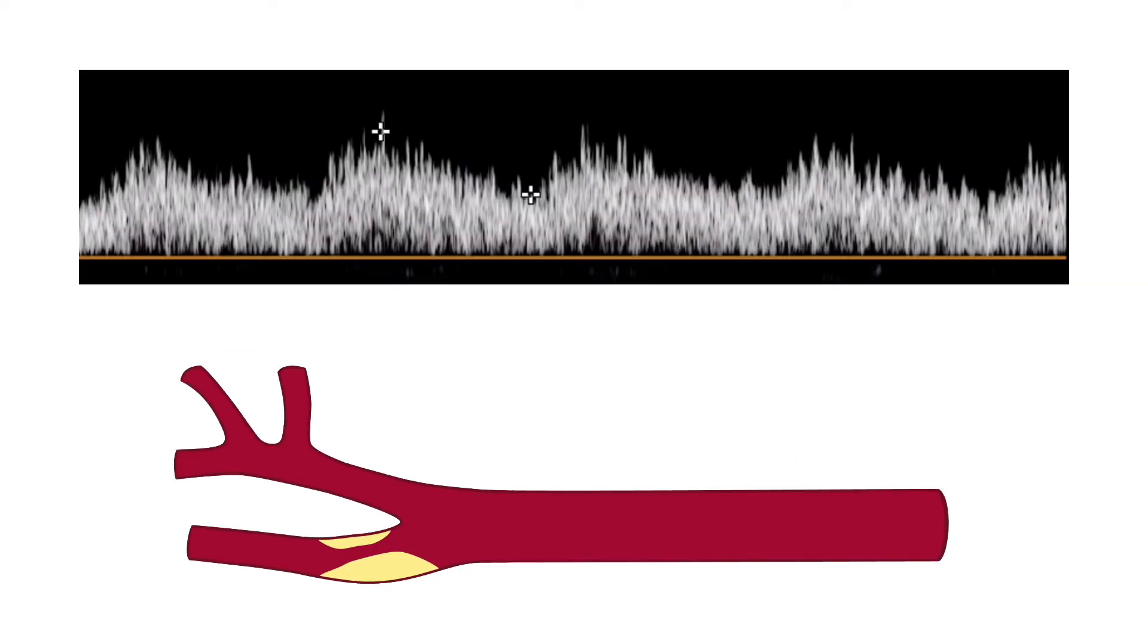In addition, a waveform demonstrating turbulent flow may be observed in the ICA, distal to a significant stenosis. If a stenosis hasn't been found on the B-mode and color flow images, but a turbulent waveform is detected, you must go back and confirm that a stenosis hasn't been missed.